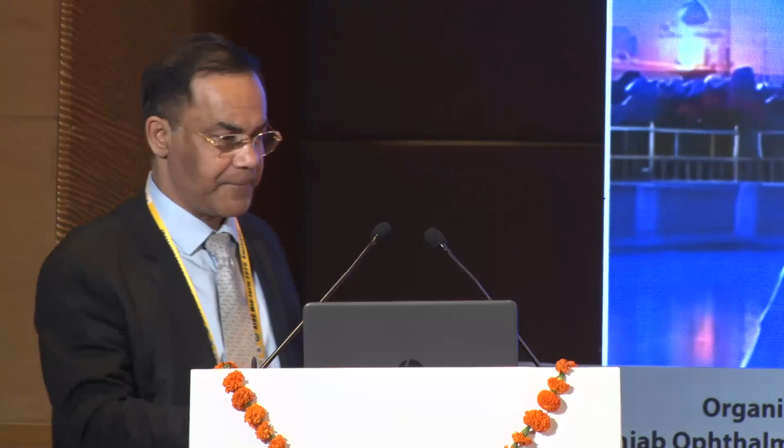As you said, you should never try flipping the lens inside the eye, whatever the endothelial count, because all these patients need to come for long-term follow-up, and the endothelial count tends to decrease year by year. So all these phakic lenses are designed in such a way that even with a wound of 2.8, you can remove it, you can reload it, and inject again. Maximum it will take hardly 5 to 8 minutes.